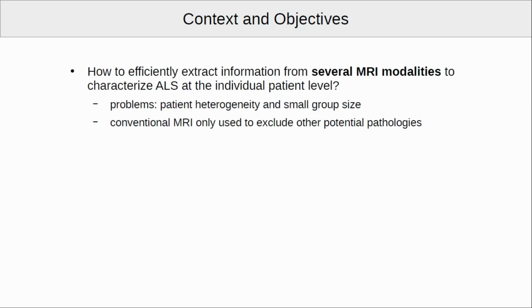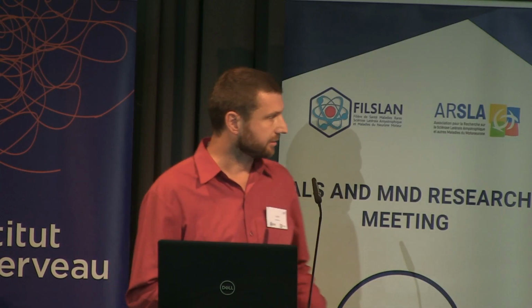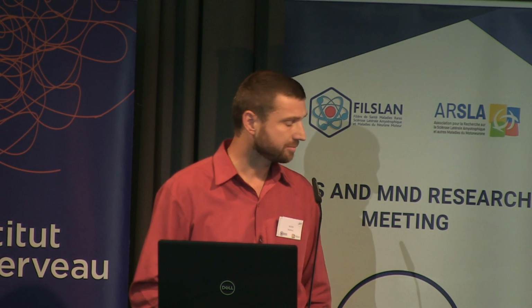As many of you may know, conventional MRI is not used in the diagnosis, so it's only used to exclude other potential pathologies. What we are using is quantitative MRI, which I'm going to introduce later, to try to get different views on the state of the brain. So what I'm going to present are preliminary results from this ongoing study.